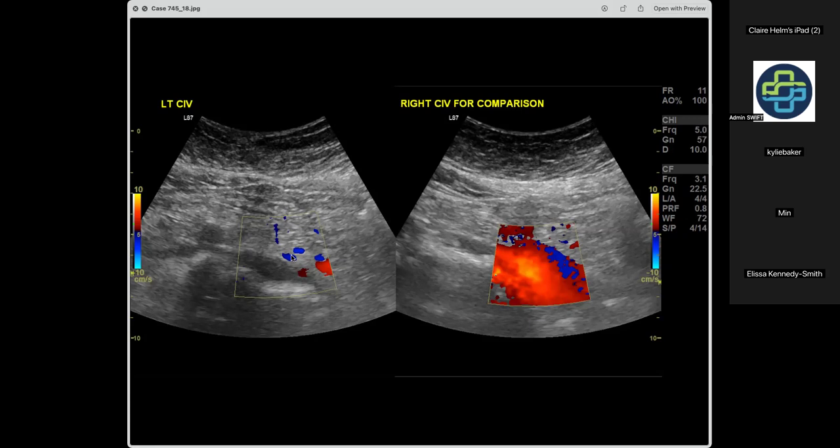But for routine ultrasounds, I think certainly for people scanning at the level we are, it is reasonable to expect that we will do the more extensive scan, and these are the cases why. These are rare. I can certainly remember 2 definite ones.